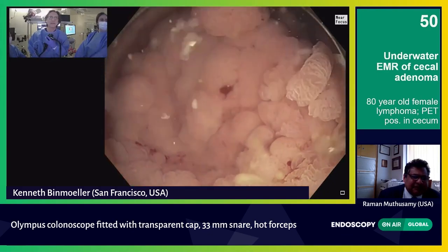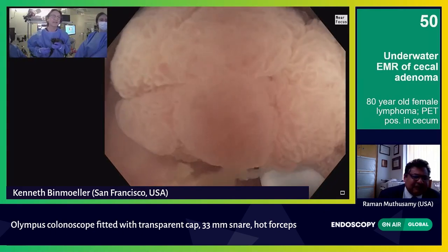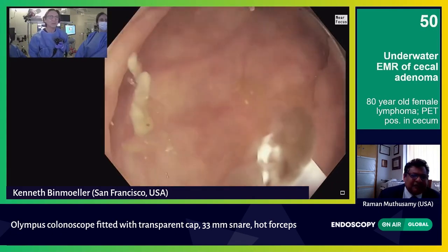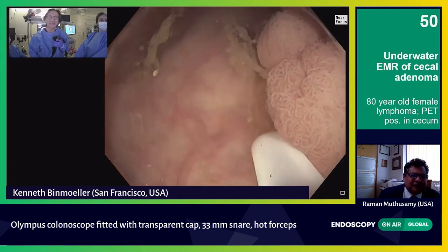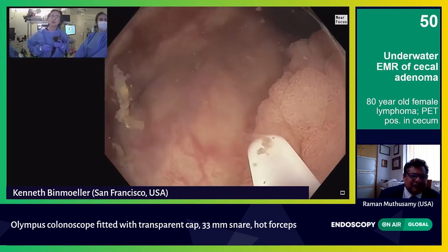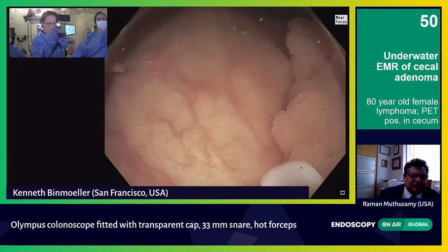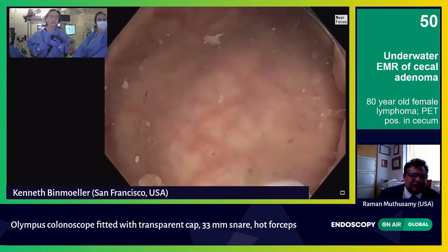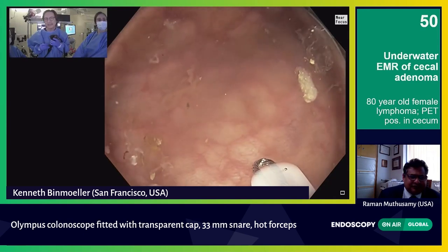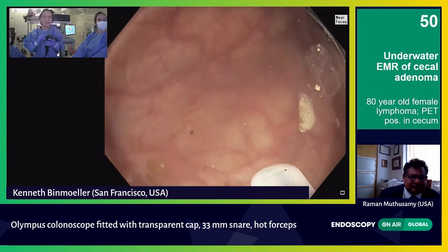Let's take the NBI off. The question is whether to take the time to make some dots around the perimeter. I don't think it's necessary in this lesion, but I always do it for SSAs because the margins are difficult to see. But I'd like to show you how I make diathermic dots around the perimeter. This is the sheath of the 33-millimeter snare — you can look through it, it's transparent — and I pull the tip of the snare until it's flush with the tip. Then using soft coag, I use the catheter.